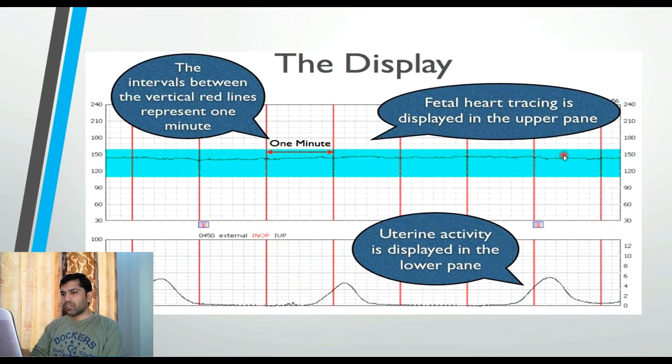With all the patient information here, the doctor decides on the treatment. The 1-minute, 15-minute and 20-minute information is here, then the doctor decides on the next treatment.